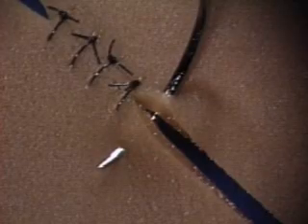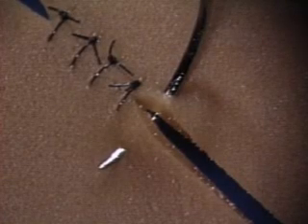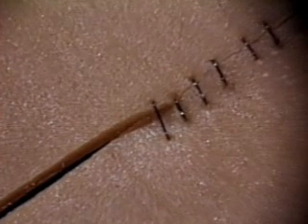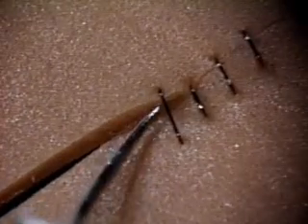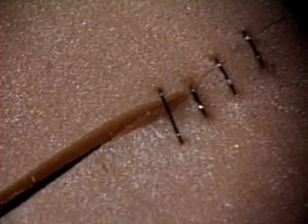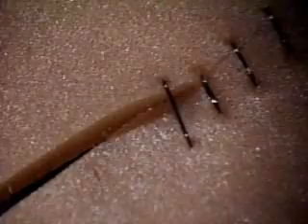The next action will be to pull the needle through, but before going on with that, we need to spend a few minutes looking first at some potential mistakes in passing the needle, and then at some important do's and don'ts in the matter of tissue handling. This would be a bad stitch. The bites are unequal. When that's tied, one side will overlap the other, and this tissue edge will be exposed to the bloodstream. In blood vessel surgery, that's bad news.